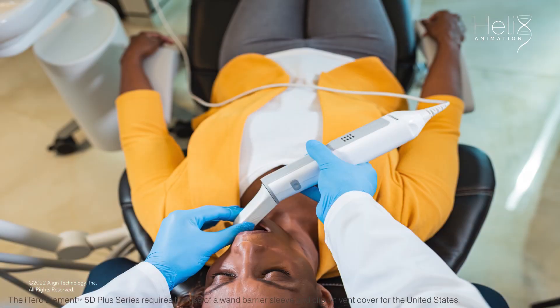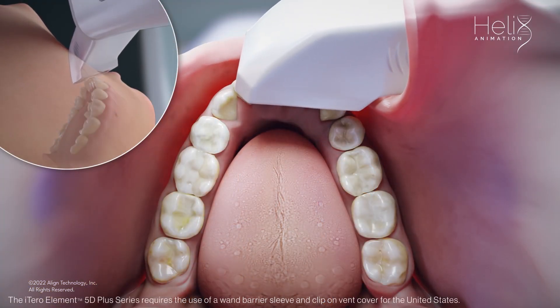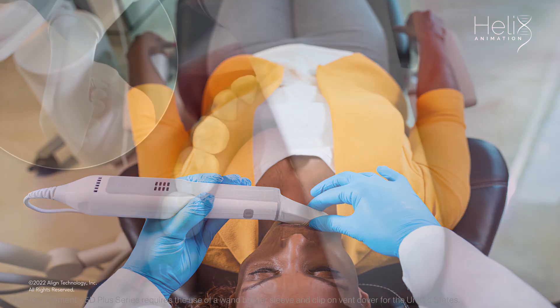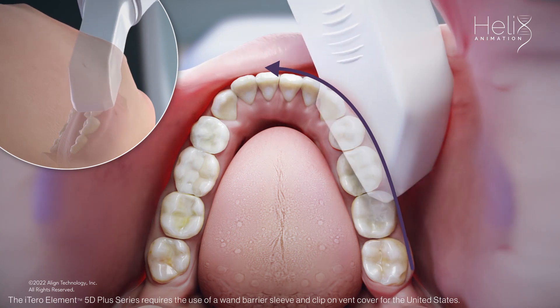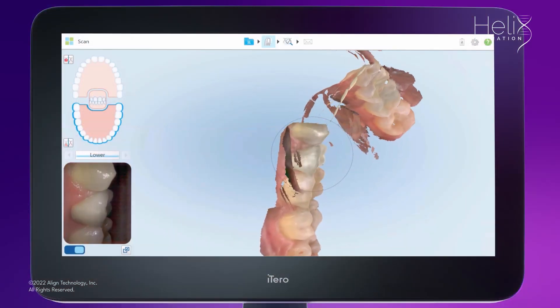The scanner sleeve is your retraction device when scanning the buccal area. When you cross the midline, move the wand tip to the opposite terminal tooth. Switch hands to hold the wand when scanning the anterior teeth and keep the wand in a horizontal position. Moving from posterior to anterior on the buccal reduces interference from the cheek and provides a smoother scanning experience for you and the patient.